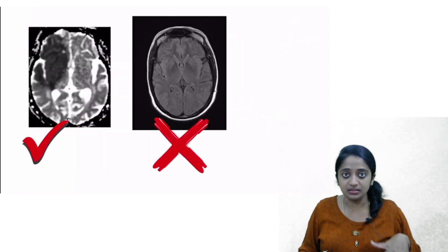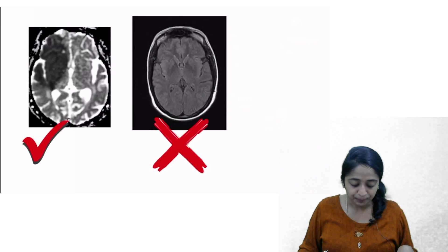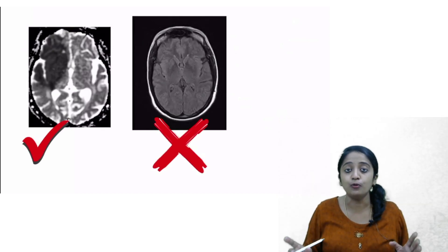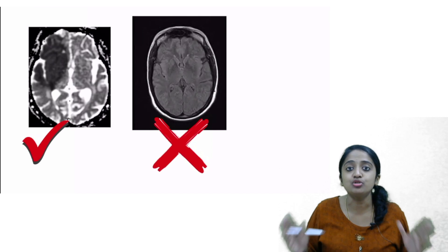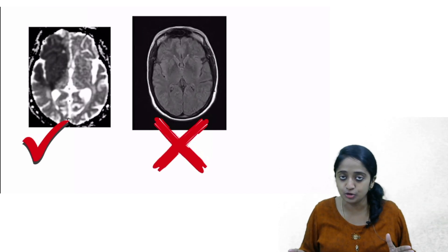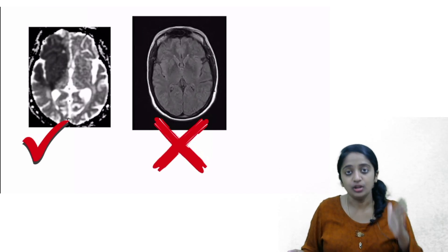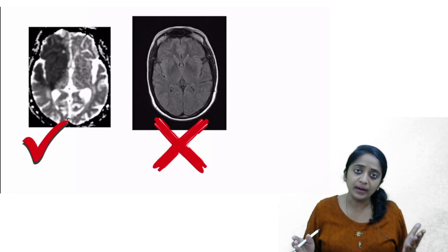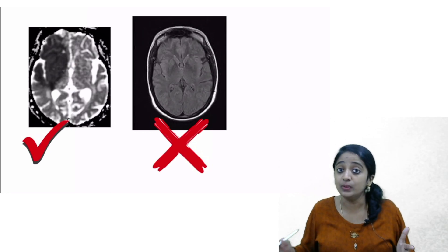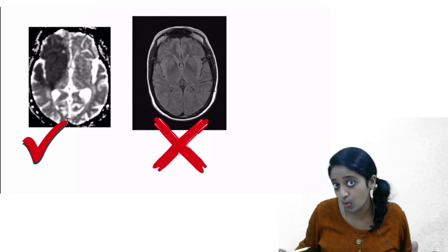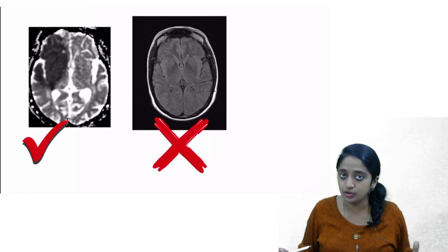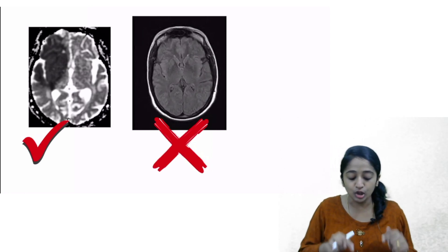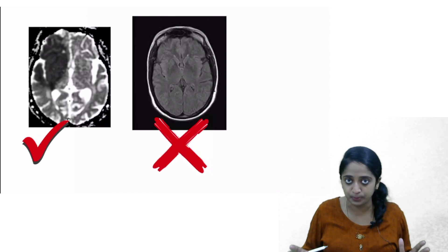Now let's take another scenario. When suspecting acute infarct, you go for MRI stroke protocol — the sequence of choice is diffusion-weighted imaging. After obtaining the diffusion-weighted sequence, you naturally proceed with other sequences, including FLAIR. Here we have two images: a diffusion-weighted image and the corresponding ADC map, followed by FLAIR.